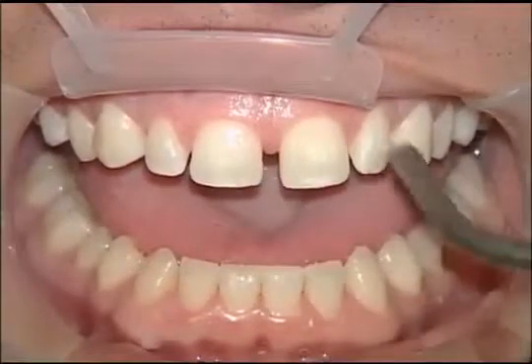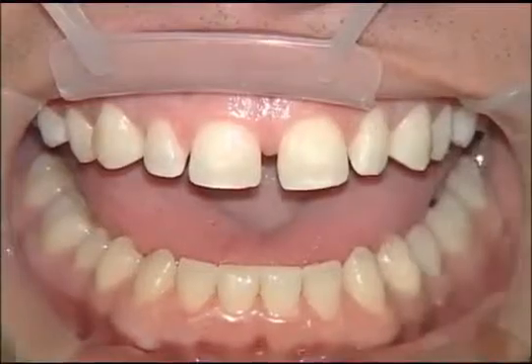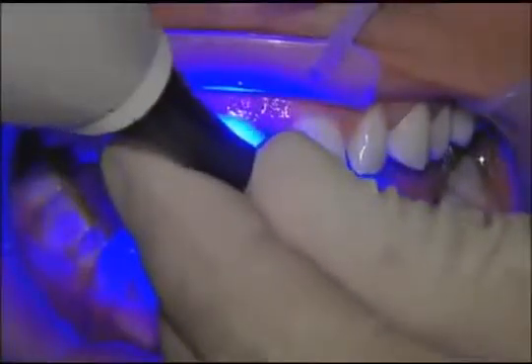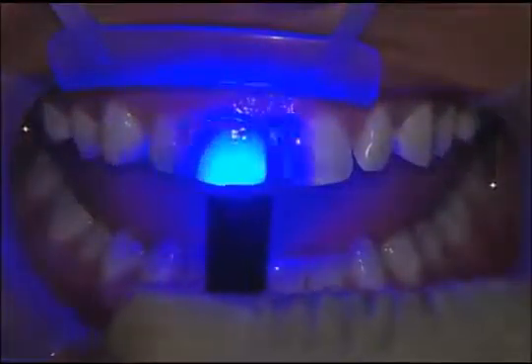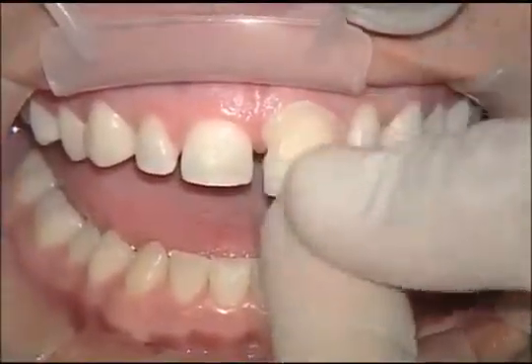This really isn't as big of a problem as it is with prep veneers, because there's nowhere in the preparation for it to pool and keep the veneer from seating. Once we've air thinned that pretty thin, we're going to go ahead and cure that. Depending on the thickness of your veneers, you could wait and cure it once the veneer and the cement are in place. And that's perfectly acceptable as well.